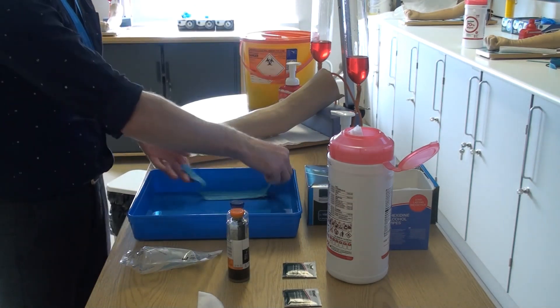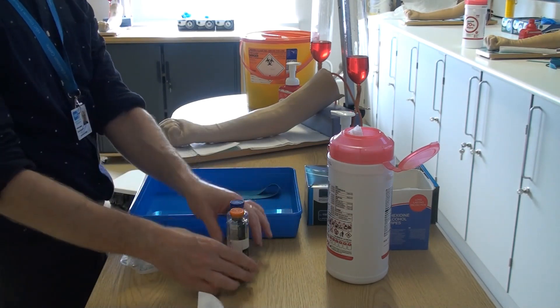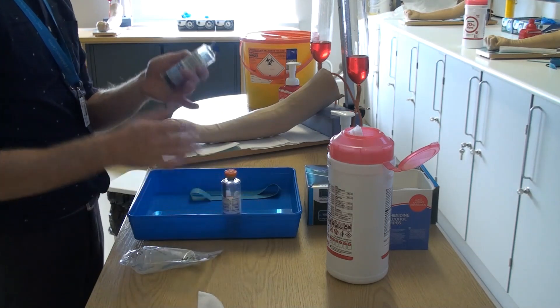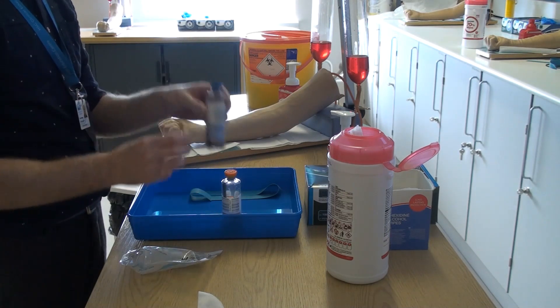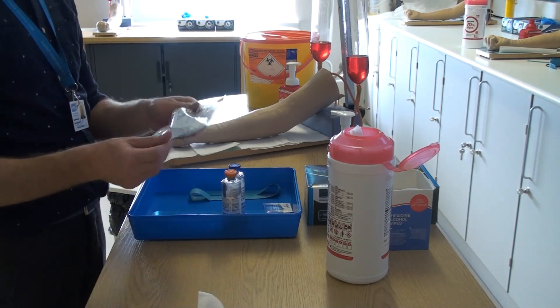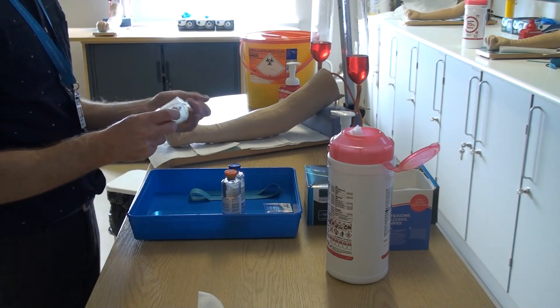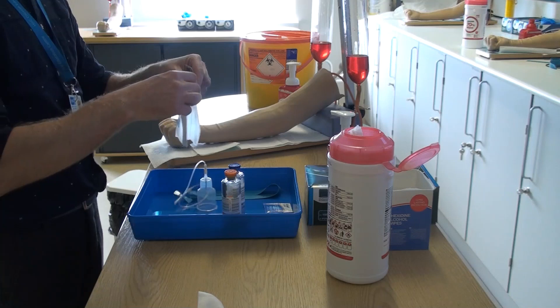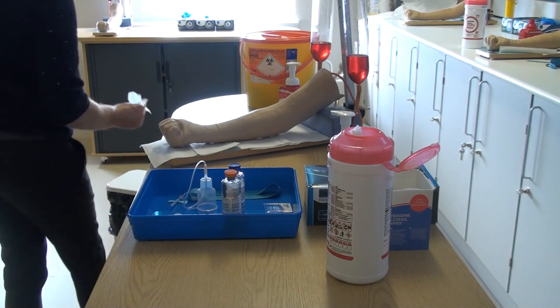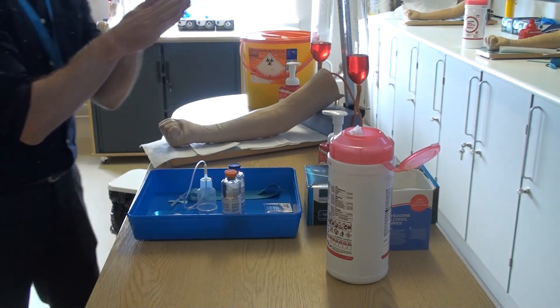Once dry, gather the equipment including a disposable tourniquet, two green clinel wipes for the tops of your bottles, an aerobic and anaerobic blood culture bottle — checking that the bottles are intact and within their expiry date — a blue clinel wipe for skin preparation, and a winged device used to collect blood culture sampling. Open the packaging and drop in, as the key parts are already protected. Dispose of packaging, place gauze in the tray, and decontaminate your hands once again.